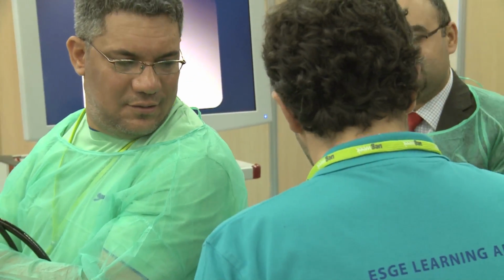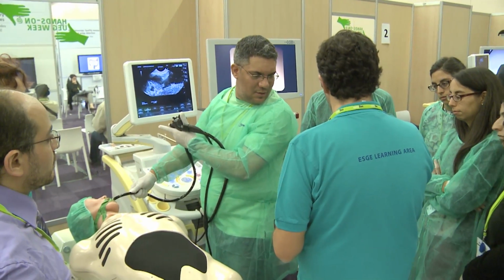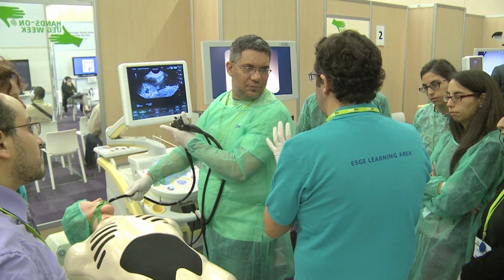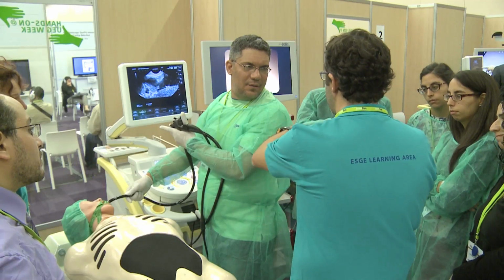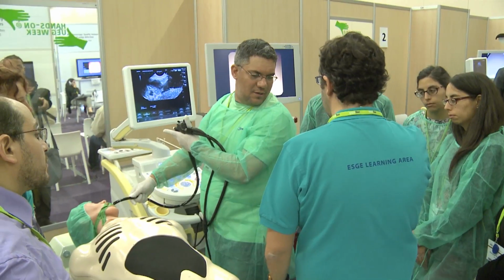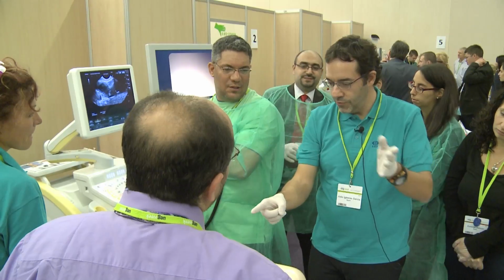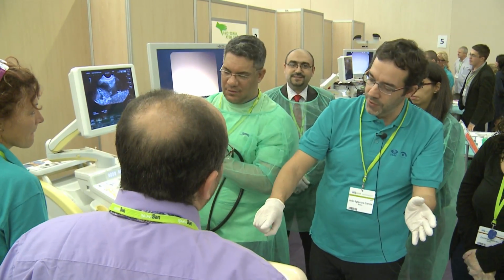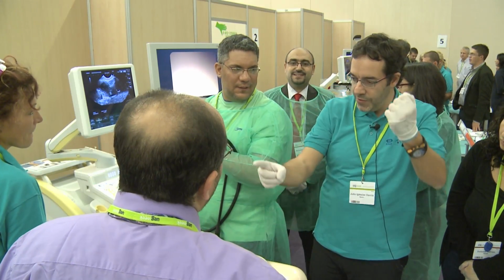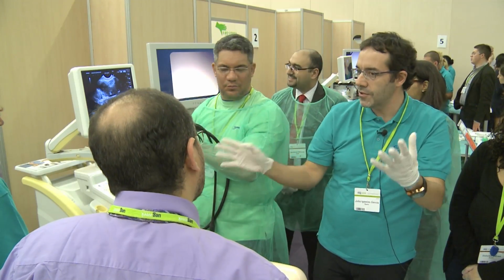If not, what do we need to do? This is not like an upper GI, where you want the scope to do something like this, to go to the retro. No. You are not going for the stomach. You are going for the surrounding structures of the stomach. So you need the scope to do this. If you do it like this, you will do something like this and something like this. No. You need to have it in this position. That's going to make it much easier.